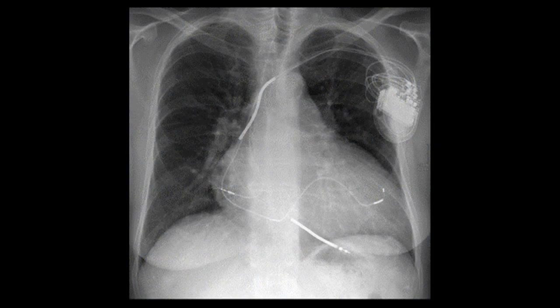Here is a biventricular ICD, usually abbreviated BIV-ICD. The left ventricular lead located within the coronary sinus is right here.